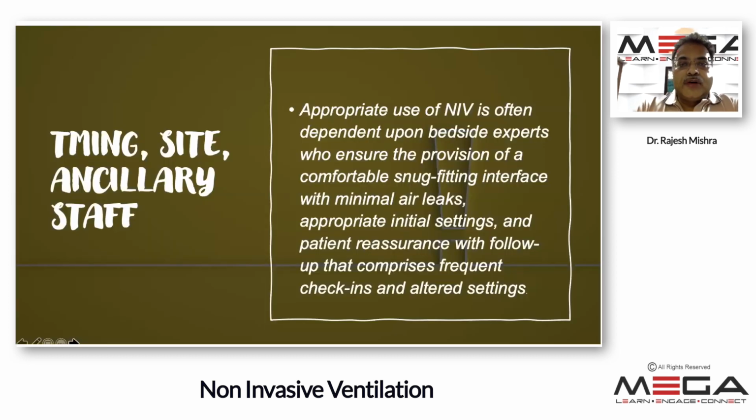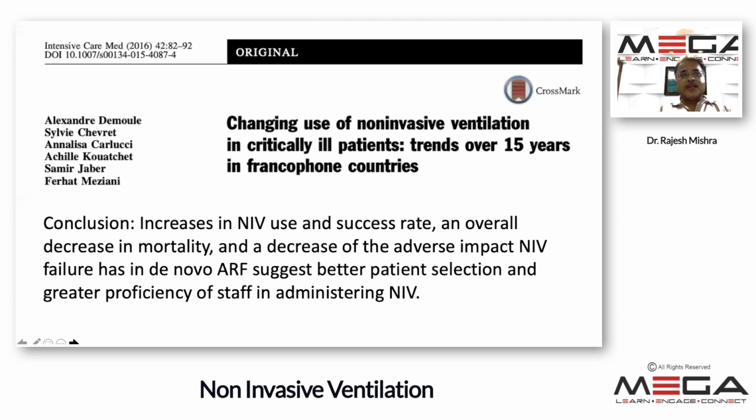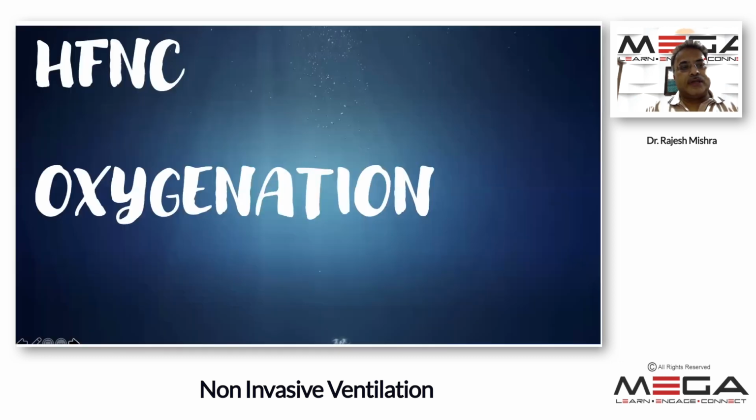One thing about the use of non-invasive ventilation is timing, site, and ancillary staff. What we have learned in a couple of years is that our nursing staff and our doctors got more trained in how to appropriately use NIV, how to comfortably fit it, how to talk to the patient, how to minimize air leak. All these have helped us in achieving a better environment to provide non-invasive ventilation, maybe for high flow nasal cannula, or maybe for non-invasive positive pressure ventilation. So we know that in the last 10 years, its use has increased.